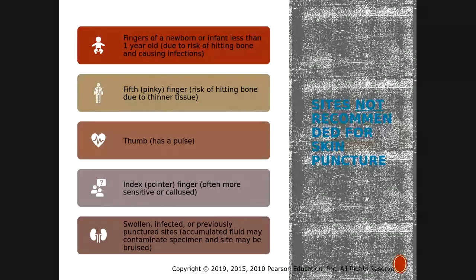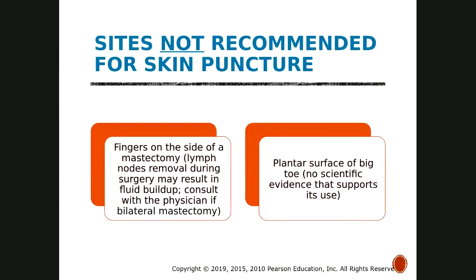Please reference the clinical alerts on page 380, as these are important. The following sites are not generally recommended for routine skin punctures, and also following up on osteomyelitis, manual non-retractable lancets are not recommended for acquiring capillary specimens. It also goes into more detail about cleansing the site. Again, continued sites not recommended for skin puncture.